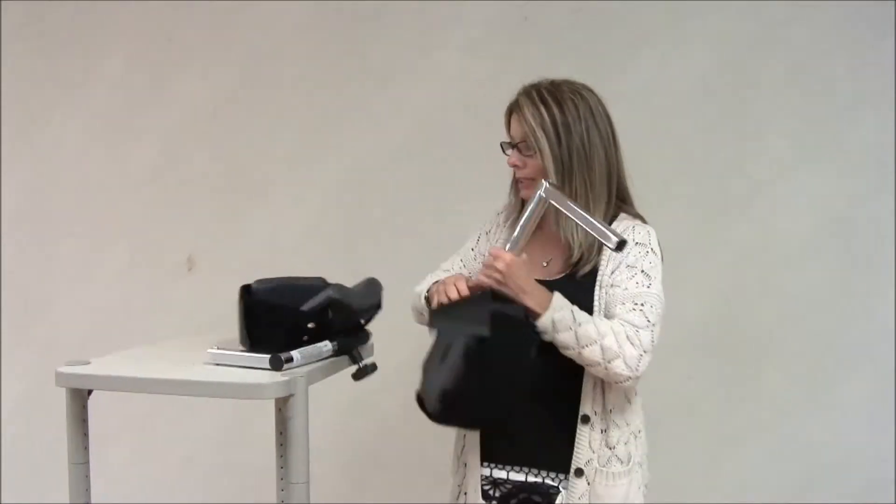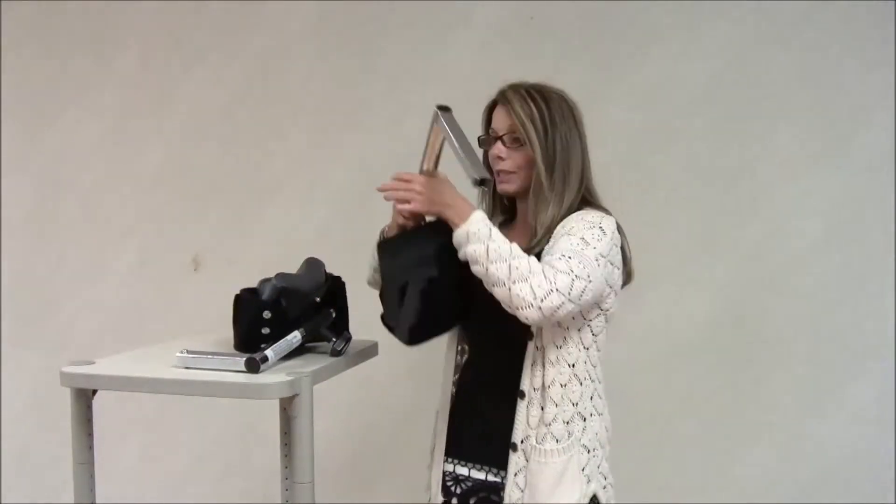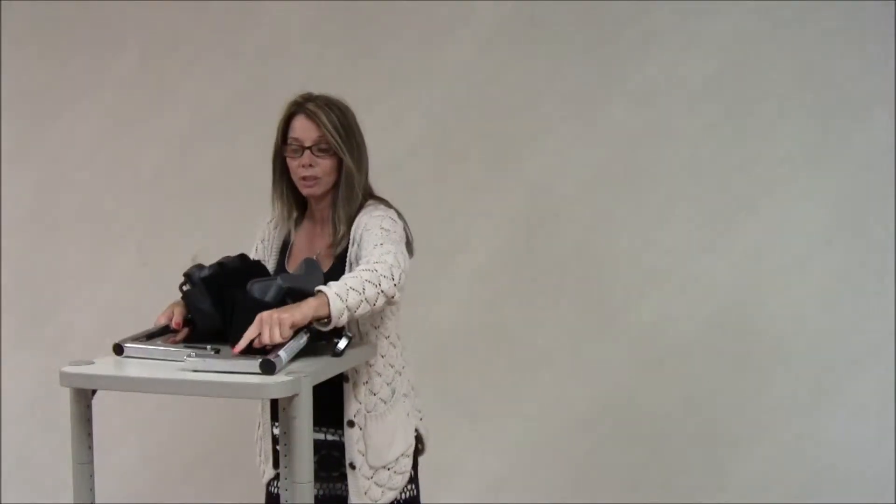Another difference that you will note is that the stem on the pediatric attachment is 6½ inches long, and on the adult it's 8½ inches long.